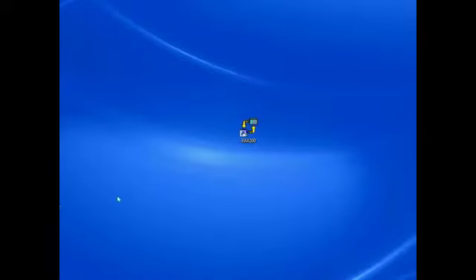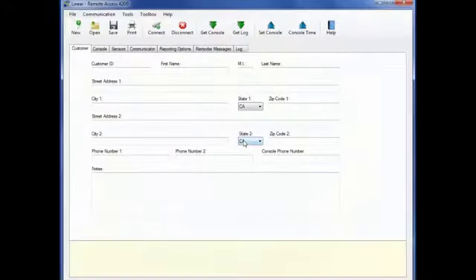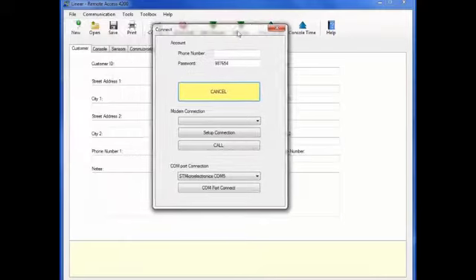Once you have downloaded the PERS-4200 software, you will click the RA4200 icon now located on your desktop. This is the PERS-4200 Remote Access menu. Before we go through each of the menu tab items, you will want to make sure that your PERS unit is connected to the software. Click the Connect button. Once you have clicked Connect on the toolbar above, a Connect menu will pop up.